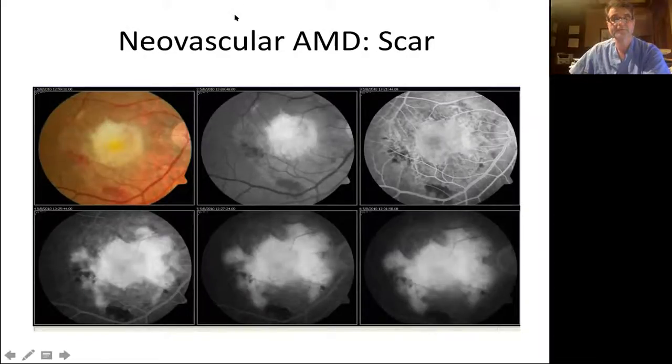One more question. What is the difference between a true and pseudo cyst? Excellent question. I want to backtrack a little bit and mention that none of these are true cysts because true cysts are lined with an epithelium, but for purposes of OCT, we often call them cysts. In any case, a true cyst or true cystoid edema involves active leakage.